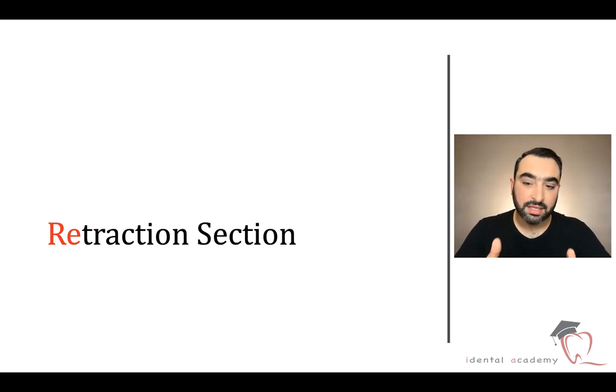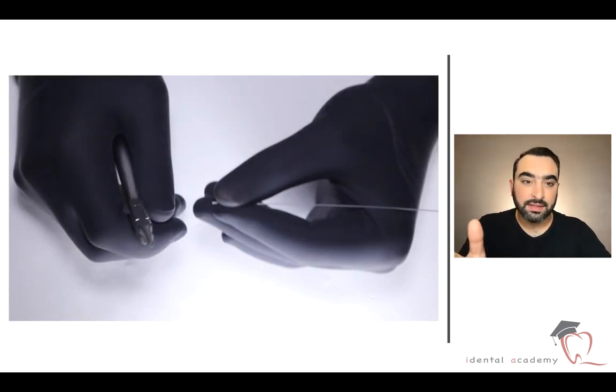So we can't put straight wire from the first stage even if we are going to use mini screw. In this case we can use retraction section that we can insert in the molar band or buccal tube or you can use it with mini screw. Let's see together how to make this retraction section - it's easy.